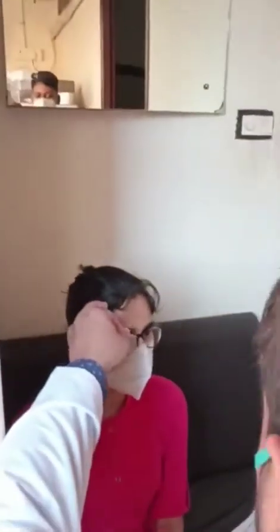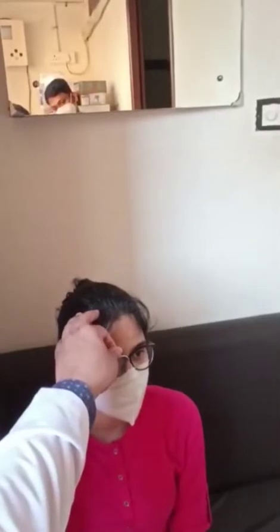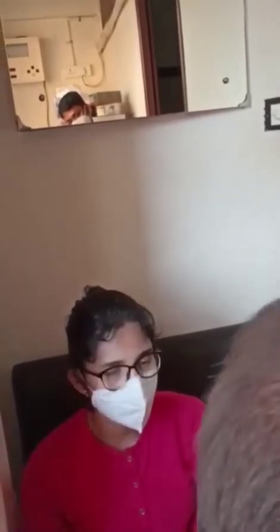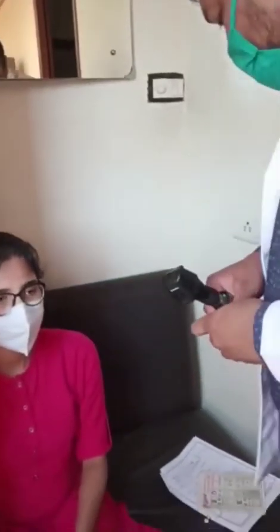Look at the target behind. Okay, your power is almost the same. So let's check it.